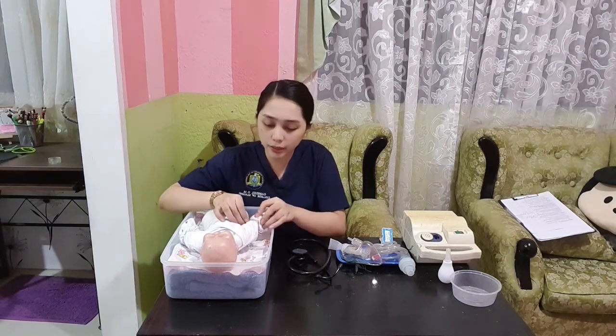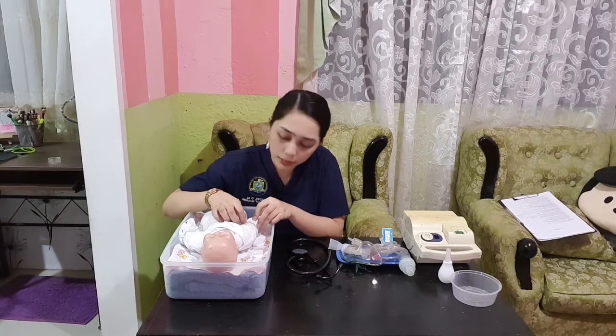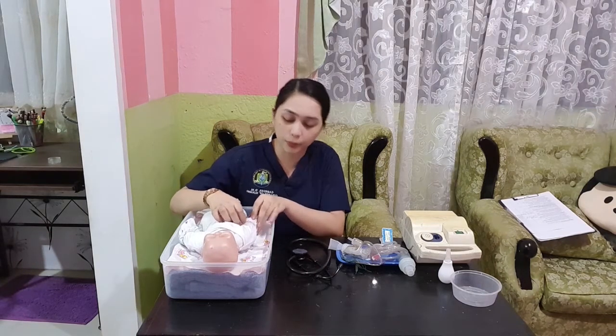the patient. Next is to identify the patient using identifiers and comparing these identifiers with the information on patient's identification bracelet. So here I am going to identify the name, birth date, and or the medical identification number.